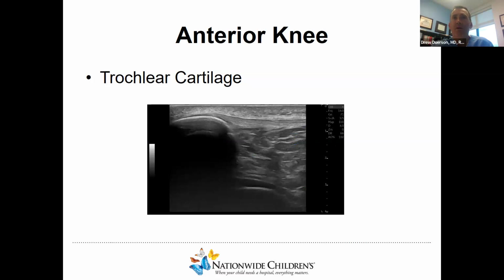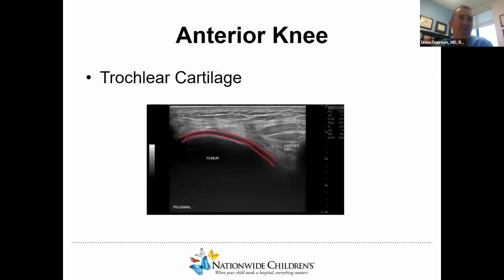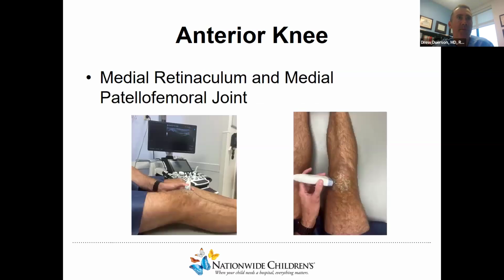So for our patient, we had to look for that trochlear cartilage with the knee extended. We can do that by adjusting your settings a bit. You may have to add some depth, decrease your frequency, and possibly even use that time gain compensation. But I think if you tilt your transducer and kind of slide laterally, you can visualize more and more of the articular cartilage as we go. And these pictures will be subsequent images starting midline and angling laterally and then sliding laterally. And then we get a pretty nice picture of the articular cartilage there in long axis. And this patient's cartilage looked normal.